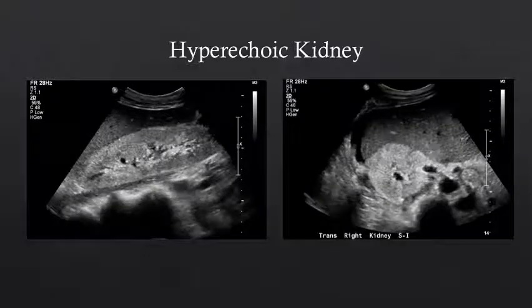Here we have an example of an abnormal or diseased kidney in a patient with chronic kidney disease. We see that the normally hypoechoic renal cortex is now hyperechoic relative to the adjacent liver.